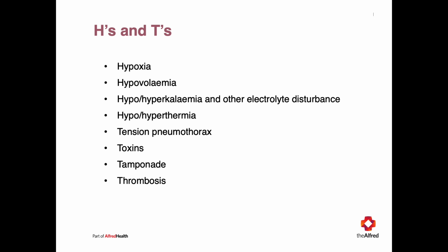The presence of waveform capnography confirms the position of the endotracheal tube in the airway. With continuous ventilation, pulmonary blood flow is the main determinant of end-tidal CO2. An end-tidal CO2 of greater than 10 mm of mercury may predict the return of spontaneous circulation.